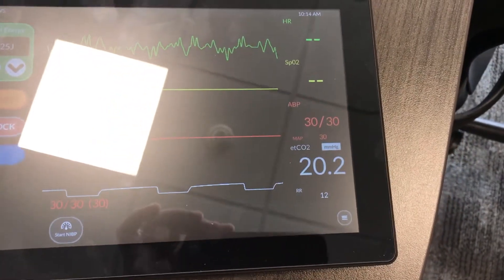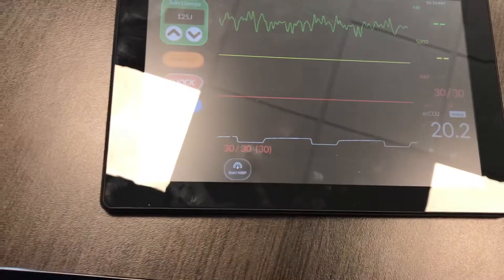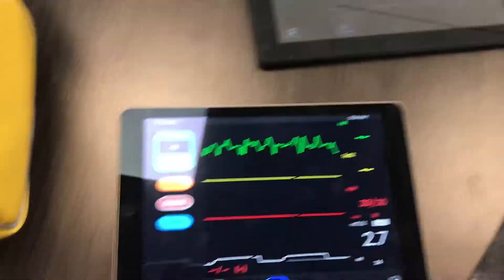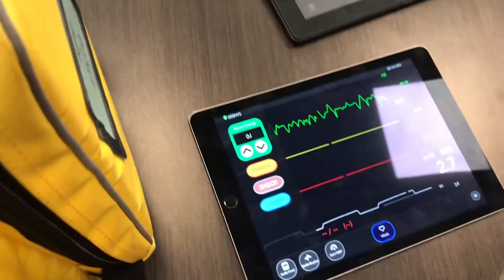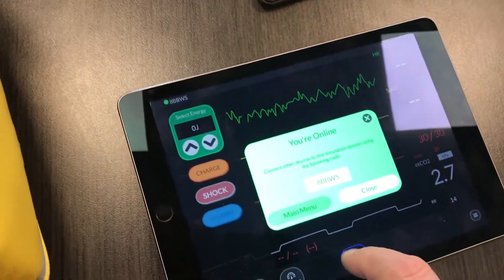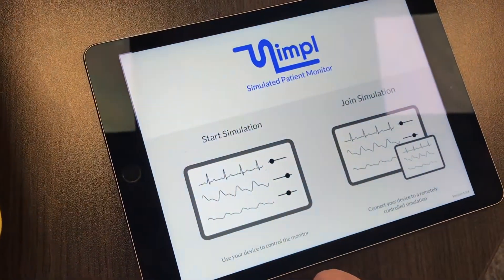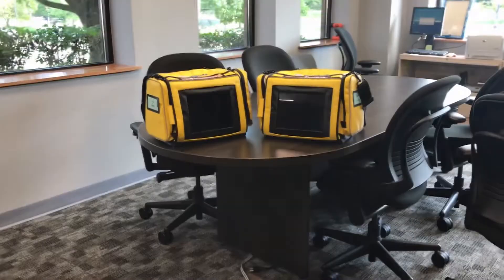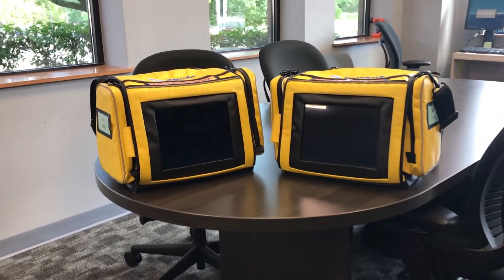The monitor is set up with everything that you need — pads, puck pad, capnography, 12-lead, 4-lead, SPO2, everything. Basically that is it. It's pretty easy to use. If you want it, just give me a call. To close out, hit the number up on top, go to Main Menu, and you're back at the beginning. Just turn off the monitors and you're ready to go. Thank you.